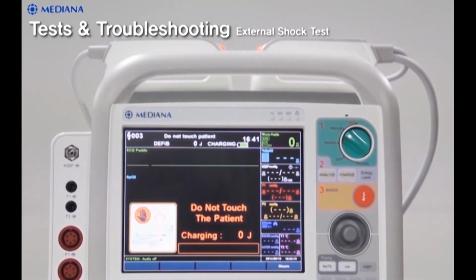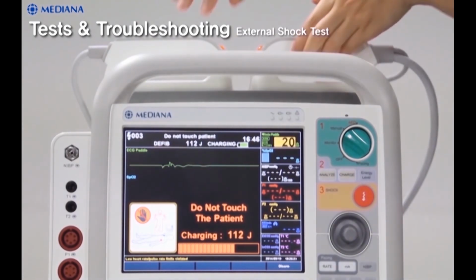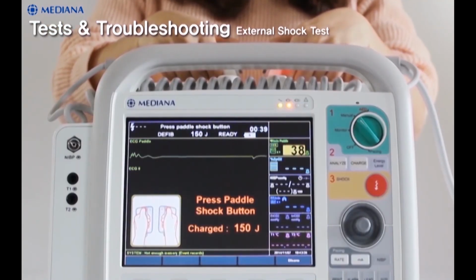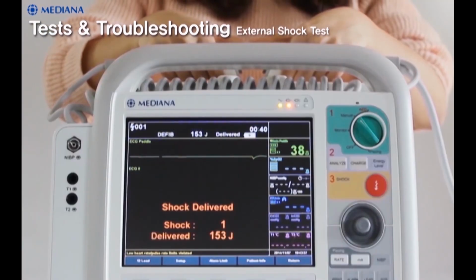Please note that before performing this test, make sure the paddles and the paddle tray are thoroughly clean and there is no residue, including gel, on electrode surfaces of the paddle and paddle tray.